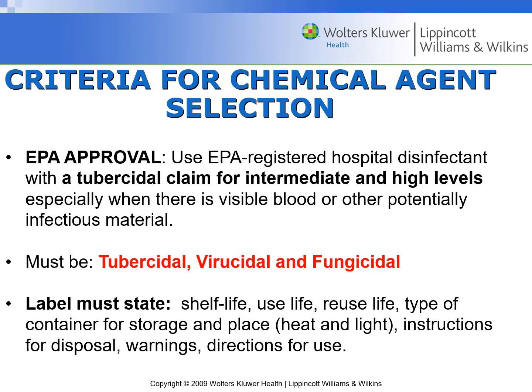The label must state on the product that you buy its shelf life, use life, reuse life, and type of container for storage and placement, whether it can be affected by heat or some kind of lighting. Instructions for how you dispose of it. You don't just throw it down the drain or throw it in the trash. Any warnings and the directions for use.